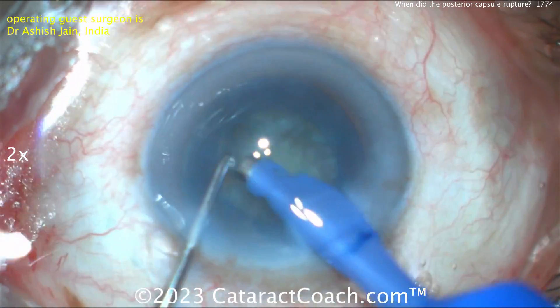Coming out of the eye. So far so good, I don't see too much issue right now. Let's speed ahead to the cortex removal — we know there's a capsule break. Beautiful red reflex. Going in now, looks like a bimanual IA setup: infusion in the right hand, aspirator coming through in the left — and oh no, the capsule's open!